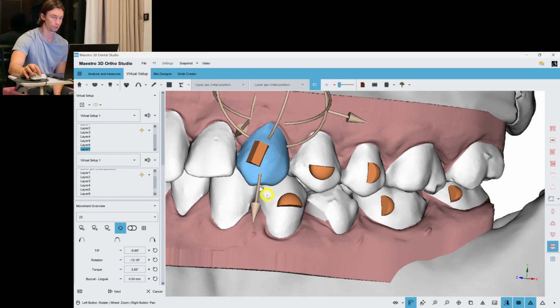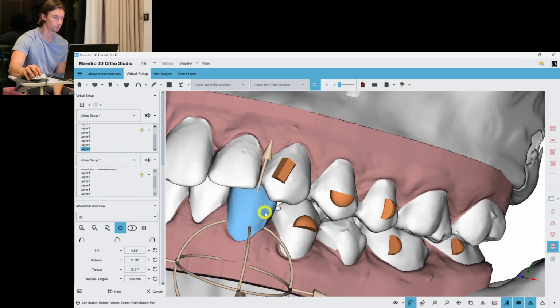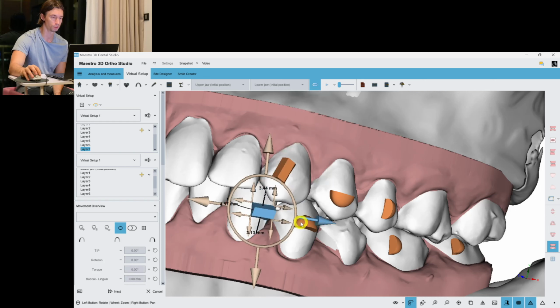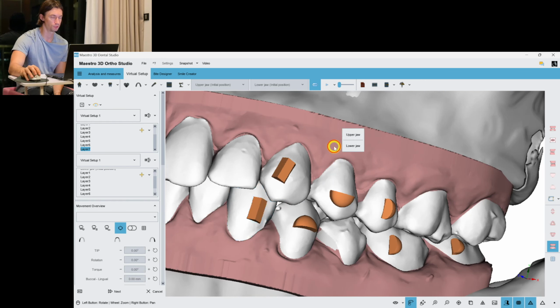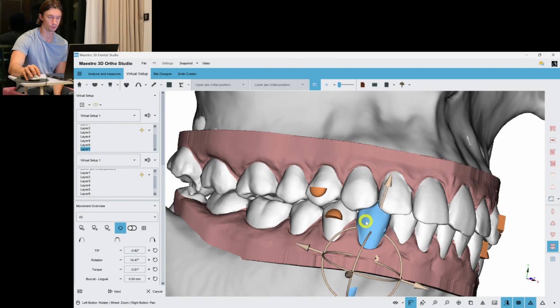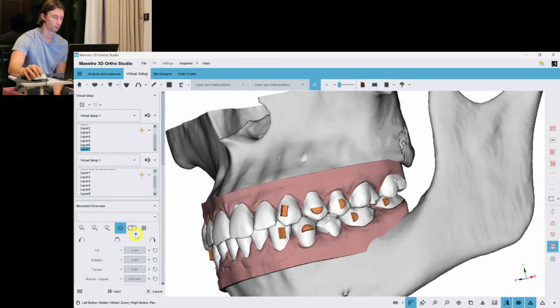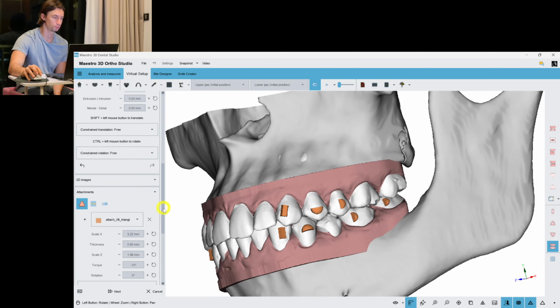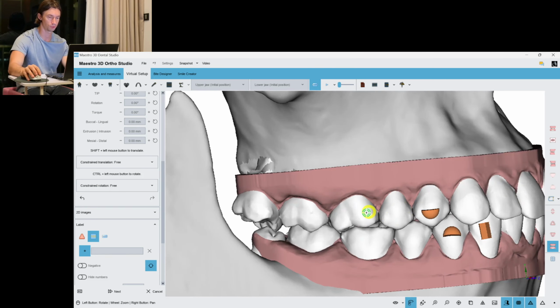So if rotation is in the distal direction, we put it more to the mesial side. Here we put it more to the distal side because rotation goes to the mesial direction. And here rotation goes to this direction as well, so we put it more distally. Don't forget to put the numbers to some posterior teeth.